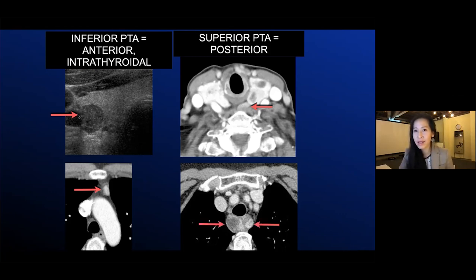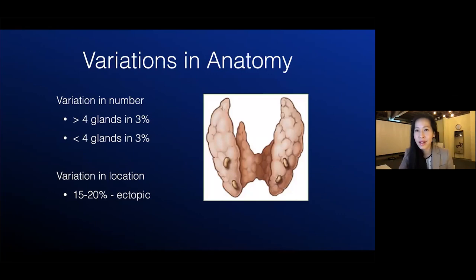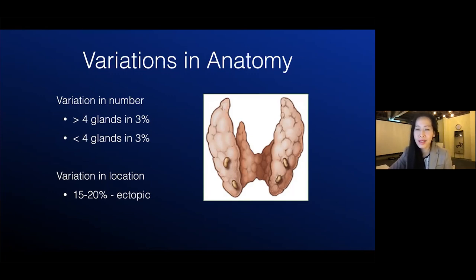Here's another mediastinal case, but the difference is this is posterior to the trachea — a pair of superior glands that have descended as far as the superior mediastinum. What makes parathyroid imaging and surgery interesting is that we are dealing with cases where there are not always four glands and they're not always in the typical locations. There can be more or fewer than four glands, and a fair number of cases that get to 4DCT involve ectopic locations, which we'll learn about in future sections.